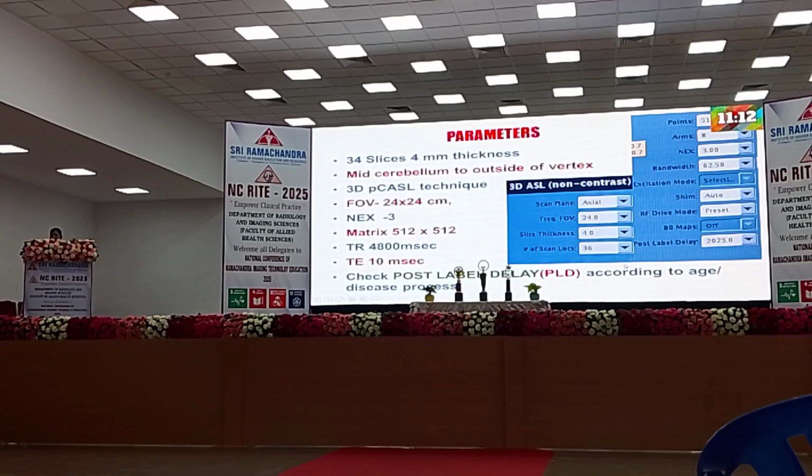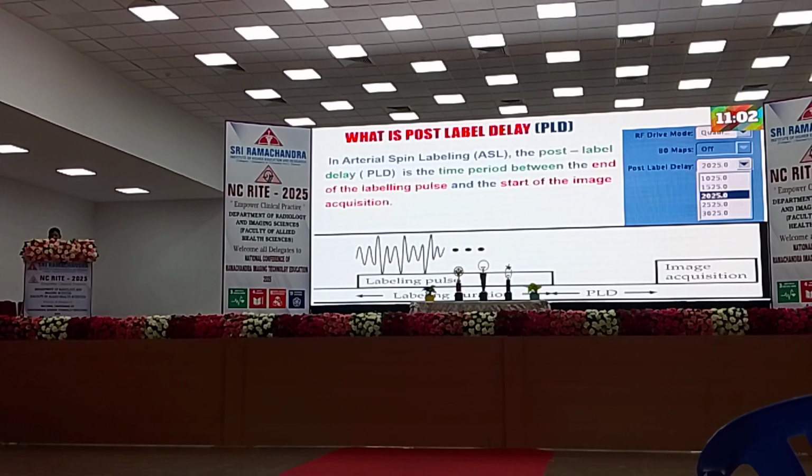It is the post labeling delay. It is the most important parameter in ASL. This post labeling delay, you have to change according to the age and the disease process. What is a PLD?